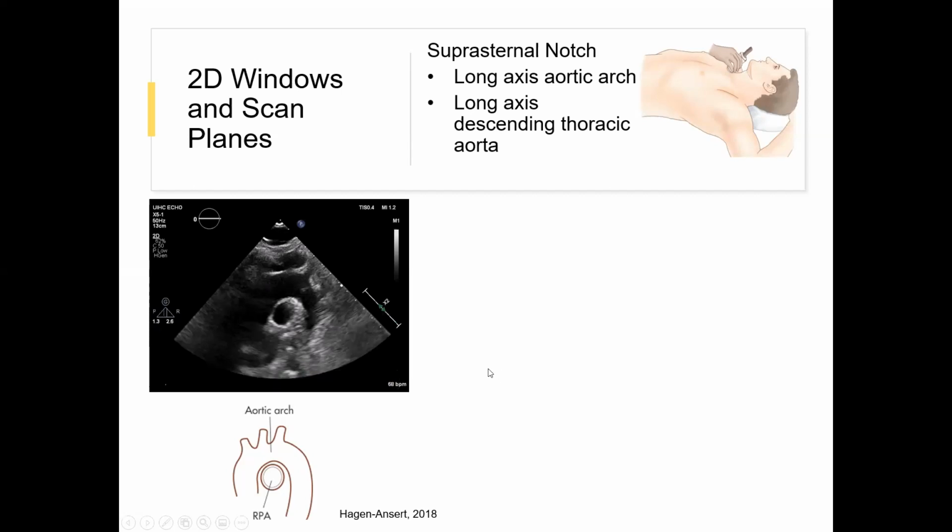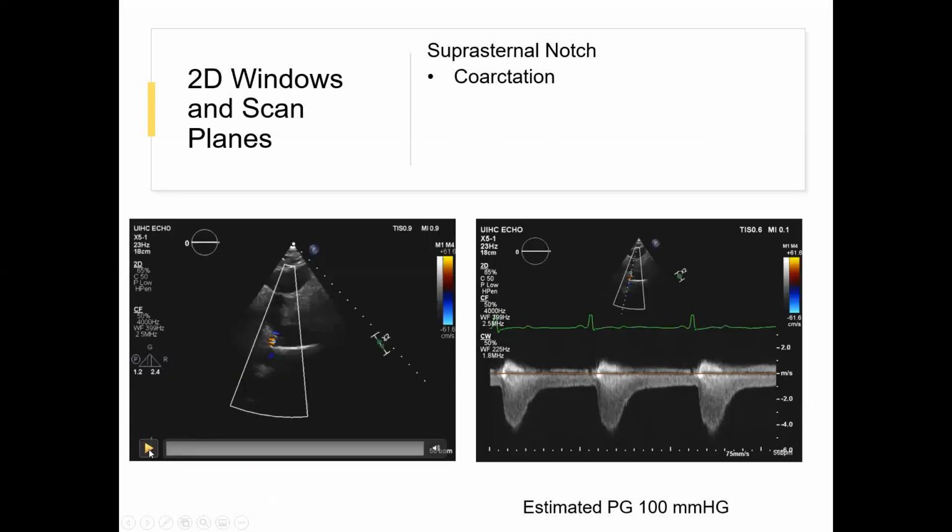Those are all end diastolic measurements. They are more difficult to see for caliper placement because we're not perpendicular to these walls, but it's supposed to be outer to inner or leading edge to leading edge as before. And again, where it can be helpful is, if you do have a situation of a co-arc, you can try to estimate some kind of size, particularly if the co-arc is a long area of narrowing.